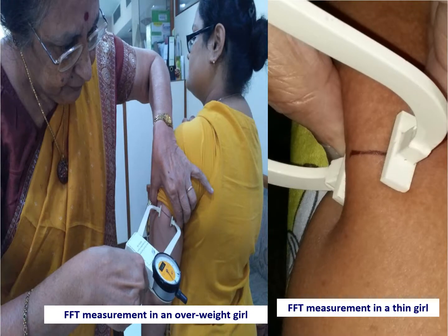In this you can see clearly the difference in mid upper arm fat fold, triceps measurement, in a thin person and in a person who is overweight. The amount of pressure exerted and ease of measurement and the pain inflicted are all more in the person who is more obese.